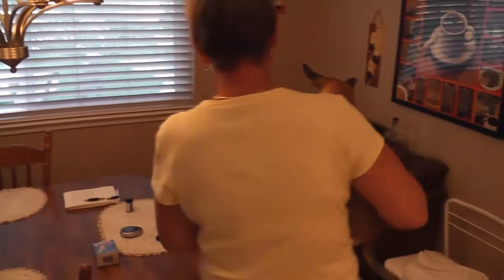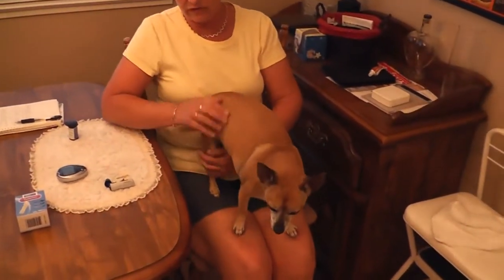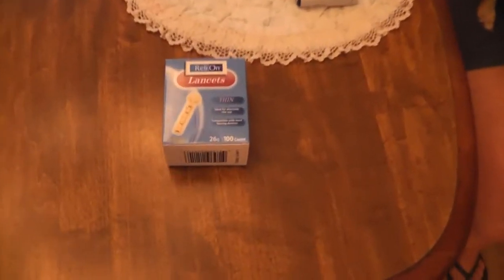We're going to test Tiggy's blood glucose an hour after she's eaten. We'll use the RelyOn — that's at 26 gauge.